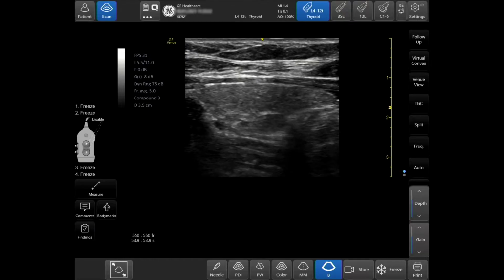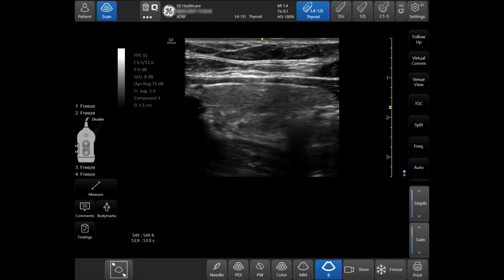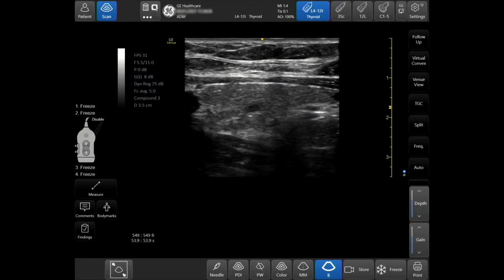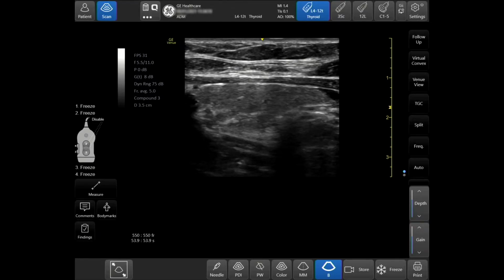All image settings in B-mode, color flow, and power Doppler imaging, as well as body patterns and comments, are automatically recalled from the patient's previous exam and are used for the current exam. This helps support technical consistency and clear conclusions for repeated exams.